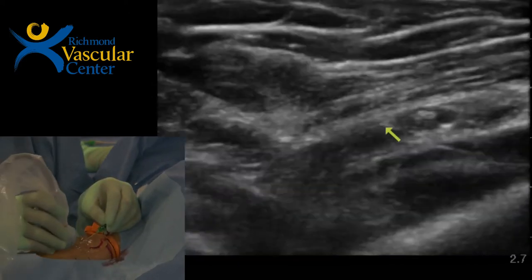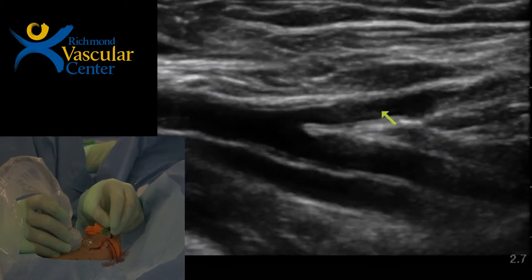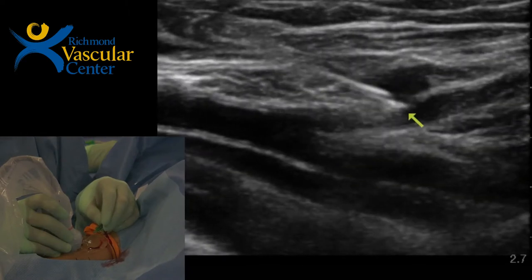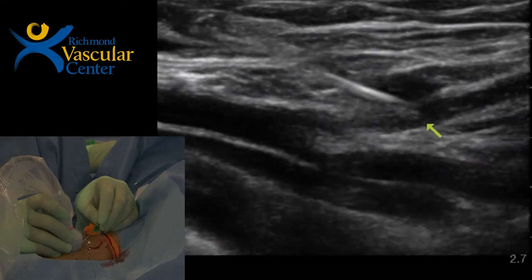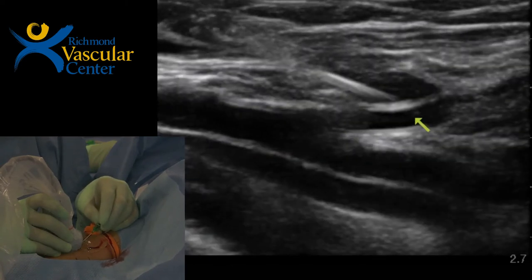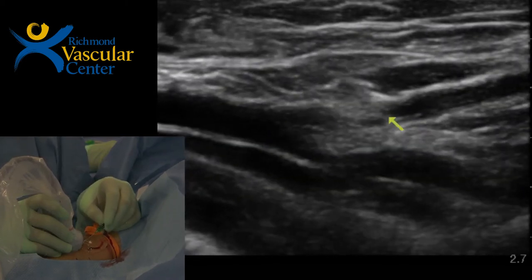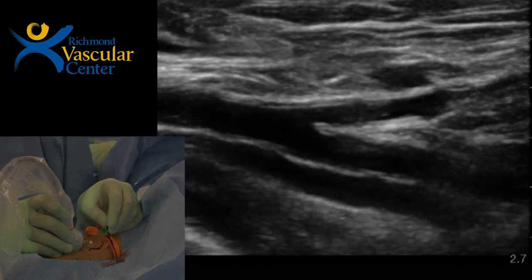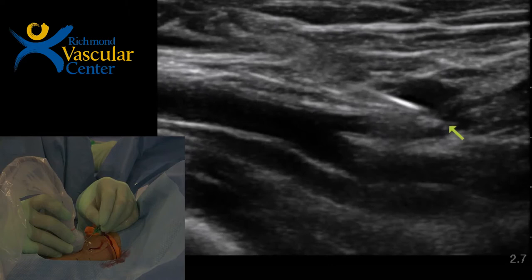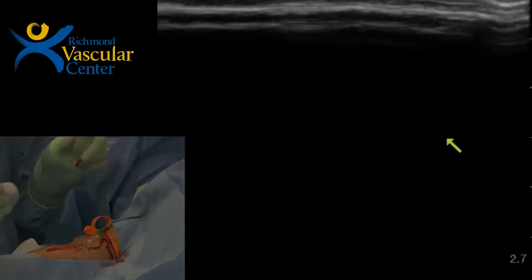So I like to look in two views here. You can see the needle tip's a little past the artery, so I'm going to pull it back a little bit. Then I'm going to swing it over on top of the artery. Yeah, so behind it a little bit. Okay. So we're in the artery.